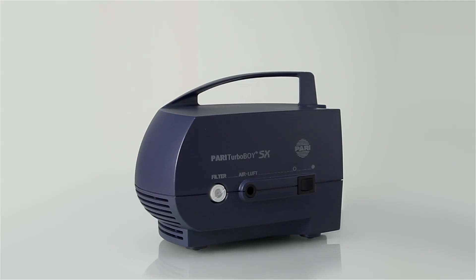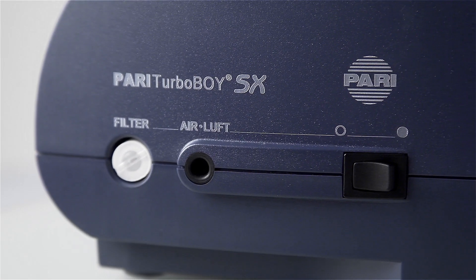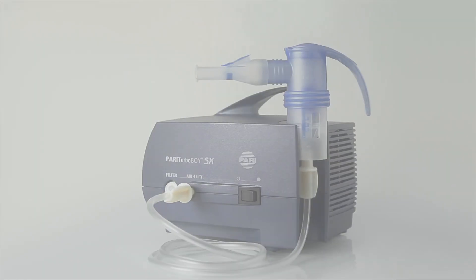The compressor is like an engine driving aerosol generation. The efficient Pari LC Sprint Nebulizer in combination with the compressor ensures short inhalation times.